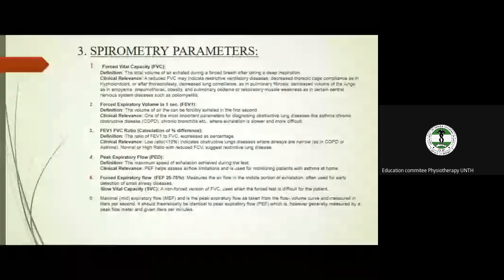Then maximum mid expiratory flow, MEF. This one is the peak expiratory flow as taken from the flow volume curve and measured in liters per second.